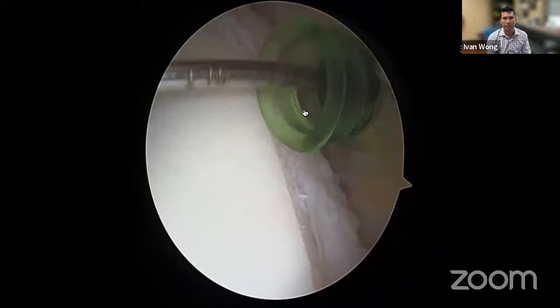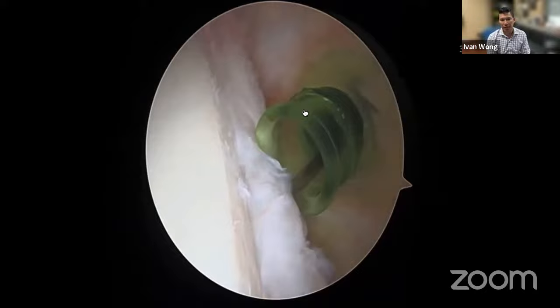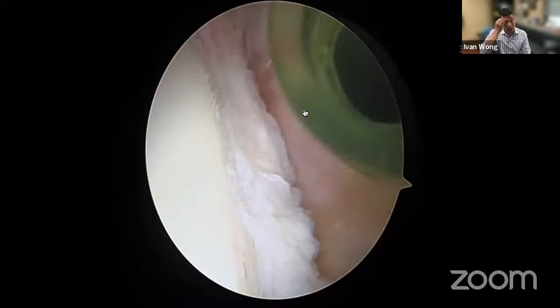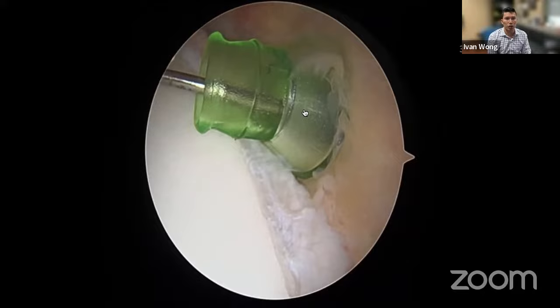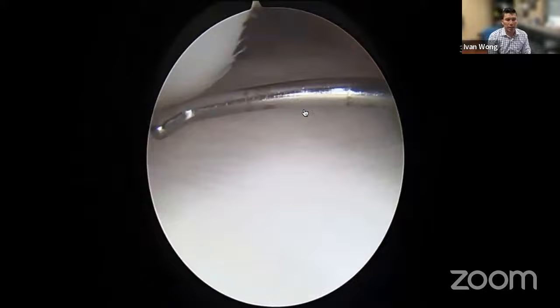First we assess the posterior portal. We can identify the posterior labrum — it looks a bit off, but still attached with no clear instability. We're not looking to do more work than necessary. We use a probe to measure the amount of bone loss. There is quite a bit of bone loss here, but this patient is part of one of our randomized studies comparing our bone block technique versus a soft tissue repair. This patient was randomized to an all-soft-tissue repair: a Bankart repair with a remplissage.